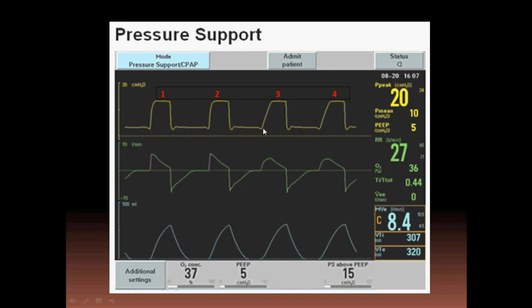Again, it is the resistance and compliance of the patient. So look at this flow also. This is the rising flow, and in this case, look at the inspiratory time a little bit more. It is smaller because the peak flow is not the same. So 30% or 35% will be smaller. So the tidal volume might decrease.